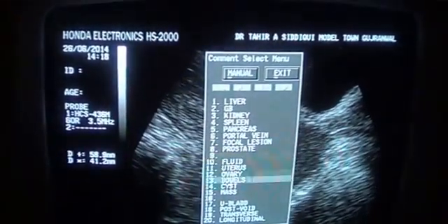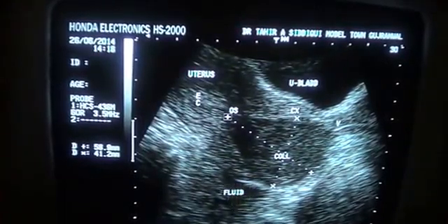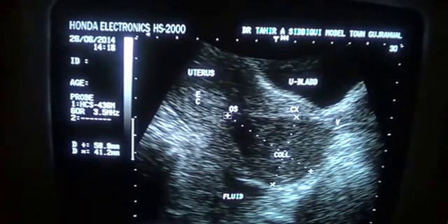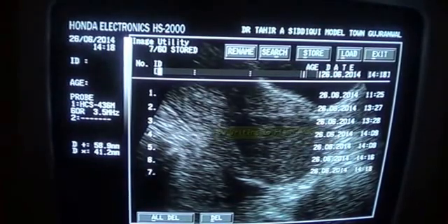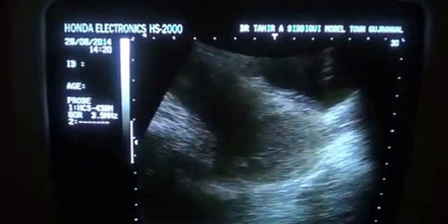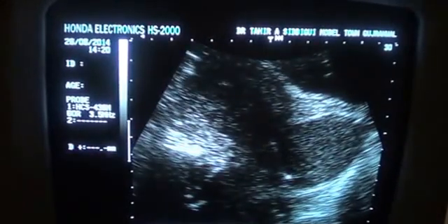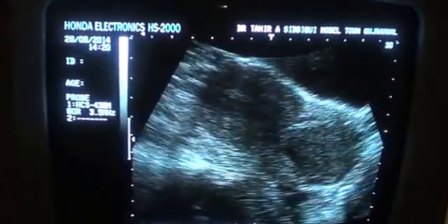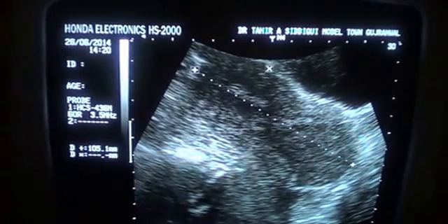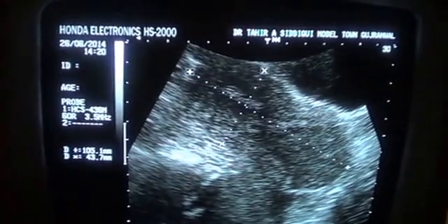Rare thing to see in a married parous female, but as I saw, I grabbed the opportunity to make a video for you. This is the small amount of fluid seen in this region. And this is the magnified view of this collection. In the collection we do see some tiny, shiny echogenic areas. As such, the whole length of the uterus, including the collection, is 10.5 by 4.3, and it will be considered as within normal. So this is our case of the day.